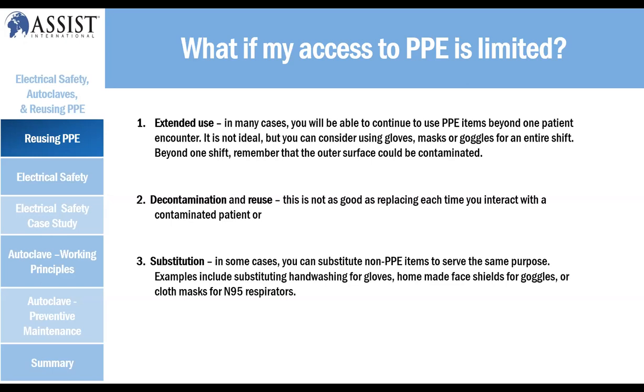And this is especially true for biomedical technicians. Clinicians sort of get priority, especially because they come in contact with COVID-designated patients. But by coming into contact with the equipment used on them, you're at just as high a risk. So we want to make sure you're protected.